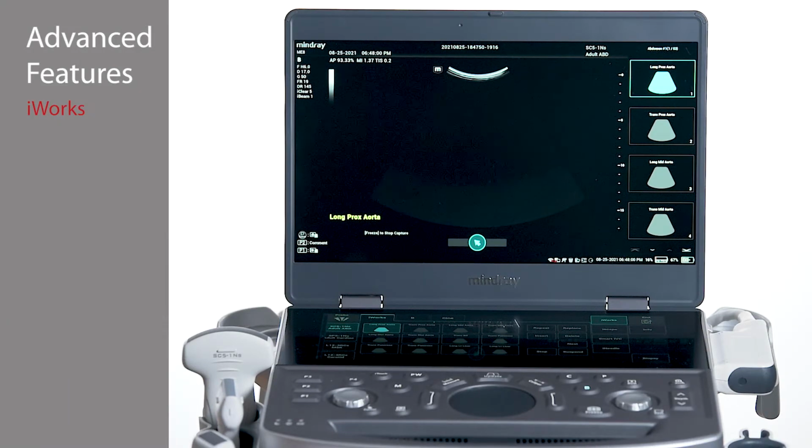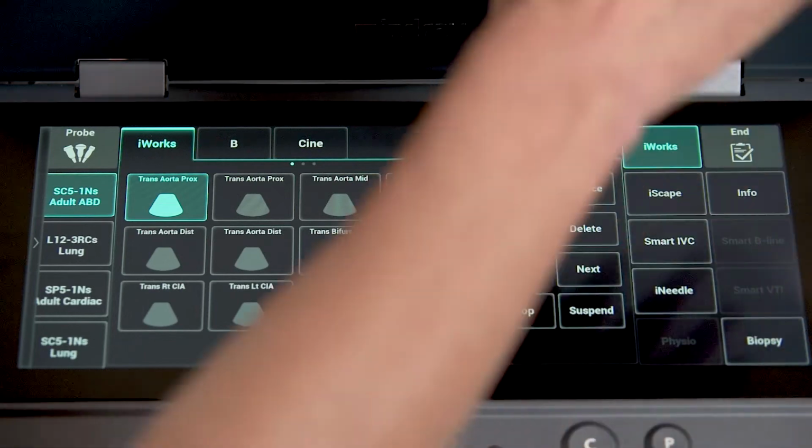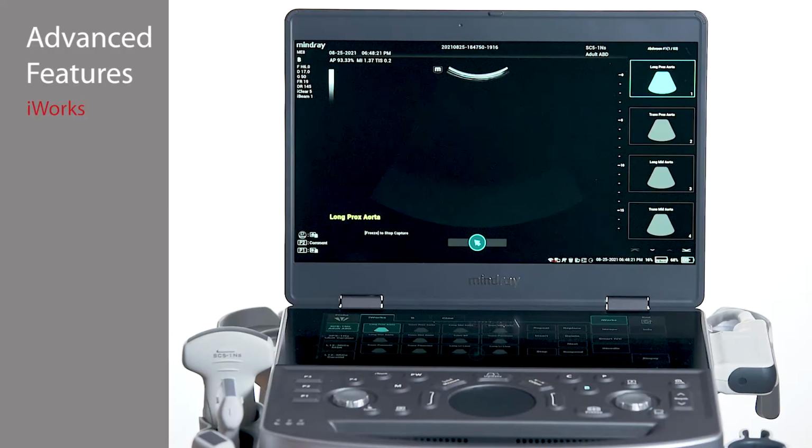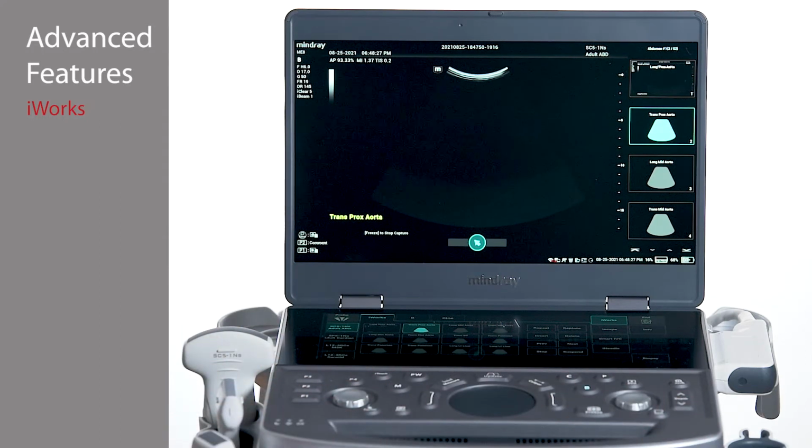iWorks comes equipped with a large library of factory protocols, but custom iWorks can also be created. An application specialist can help build custom protocols to desired specifications. Once a protocol has begun, the views will be displayed as thumbnails on the right side of the monitor and on the touch panel, as well as any associated annotations. Obtain the view and tap Save or Save Clip to store.